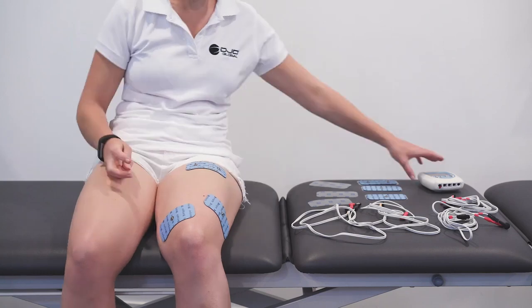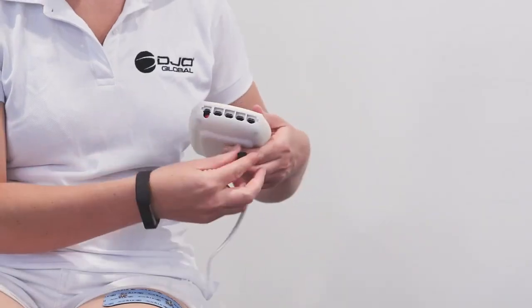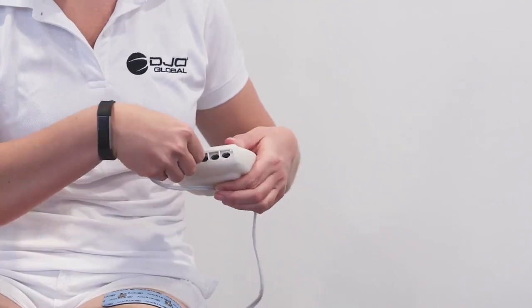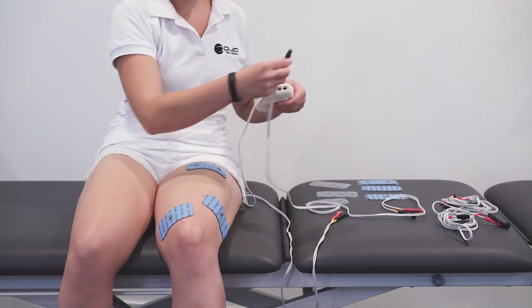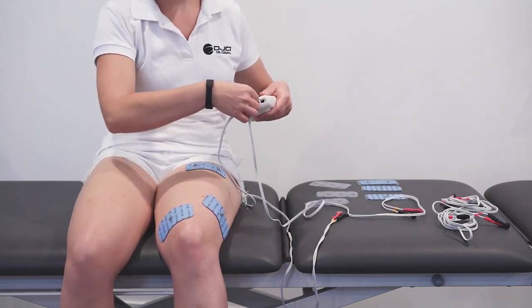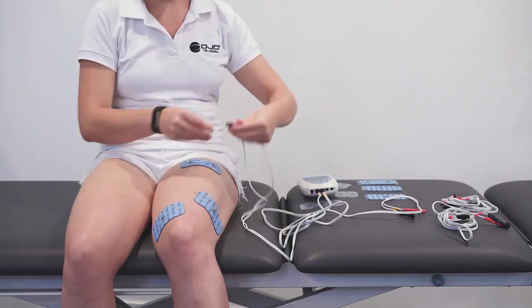Now connect the electrode wires to the electrode pads and channel 1 and channel 2 of the handset. Make sure that the ends click in, and always make sure that the red lead is furthest from the heart.